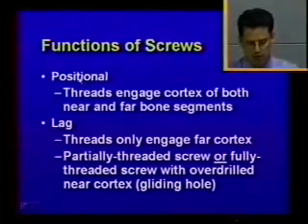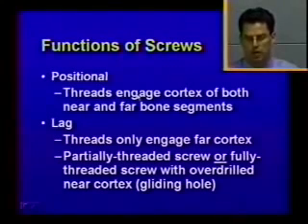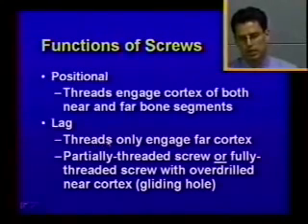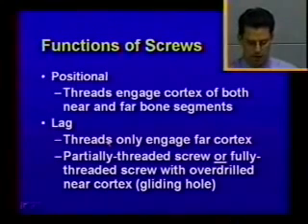Two different functions of screws are to be either positional, where the threads engage both the near and the far cortex, or screws can be used as lag screws. With lag screws, the threads are only going to engage the far cortex. This can be achieved by using a partially threaded screw that doesn't have threads on the first half of it, so they won't engage the near cortex when tightened down.